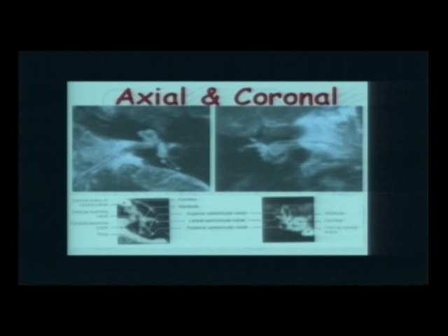You see the beauty of the MRI? Right now, we see everything in white. So we have to see as if we're seeing the opposite way. This is the basal turn of the cochlea, the middle turn, and the flat-topped apical turn, with the modiolus. And here is the vestibule, the lateral canal, the posterior canal, and the internal auditory canal.